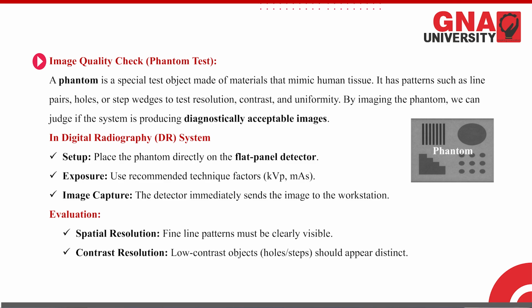When we expose this phantom, the detector immediately captures the image, and the image will be displayed upon the monitor, or we can say upon our workstation. What we have to evaluate in that image is the spatial resolution. That is, the fine line patterns must be clearly visible with proper distance. For contrast resolution, low contrast objects, holes, and steps should appear distinct with a proper structure.